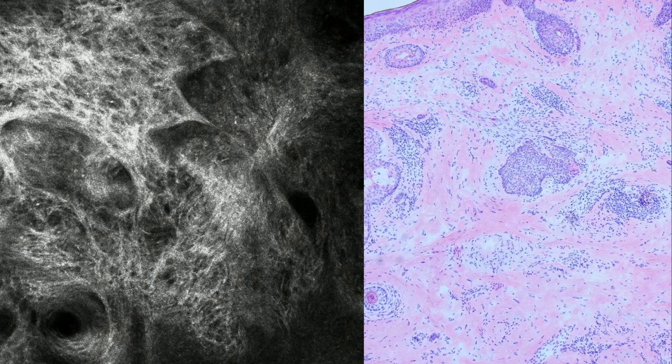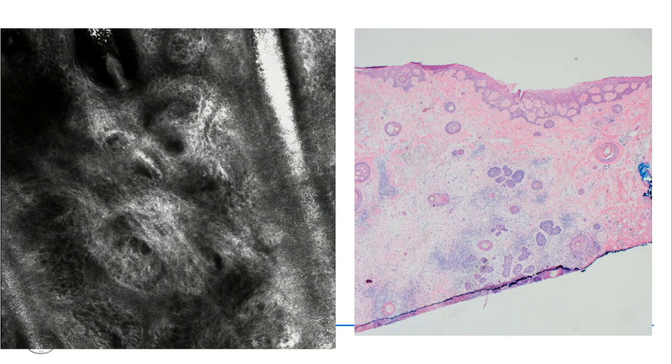But these aren't X-rays, right? It's just light. It's just light in a very distinct pattern and a focused manner, which is so cool. And patients love it in real time. The fun thing about our job is that we can use this in real time with patients watching the screen. So they're visualizing it as you are visualizing it.